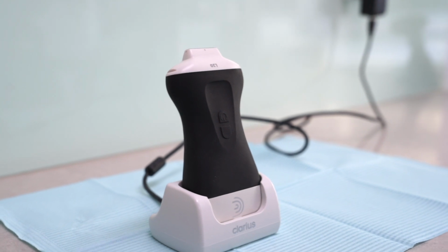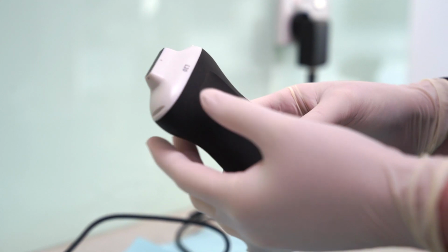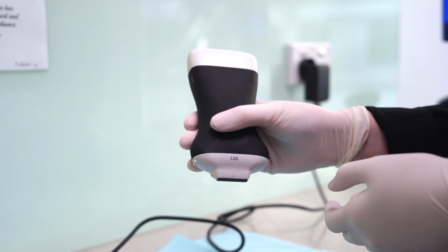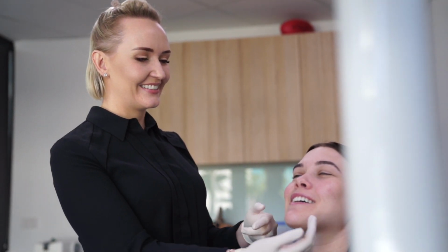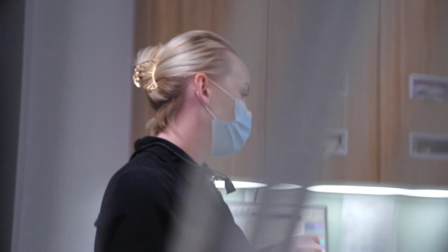This is a handheld ultrasound device which can be used in clinic to preoperatively assess a patient's anatomy and vascular pattern prior to injection of hyaluronic acid dermal filler. What I'm showing you today is the 7 transducer positions which have been described in a paper by Velthuis.